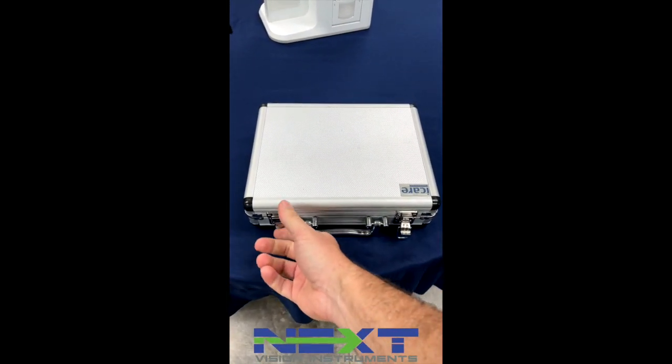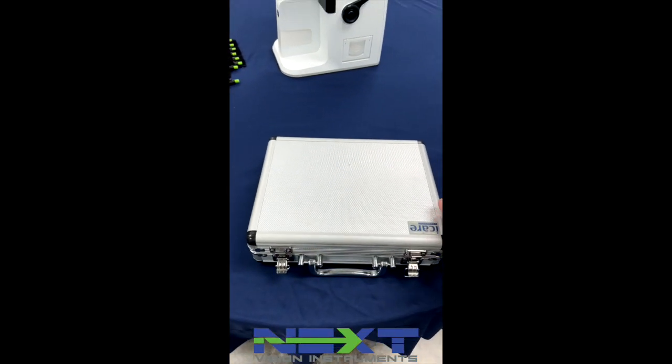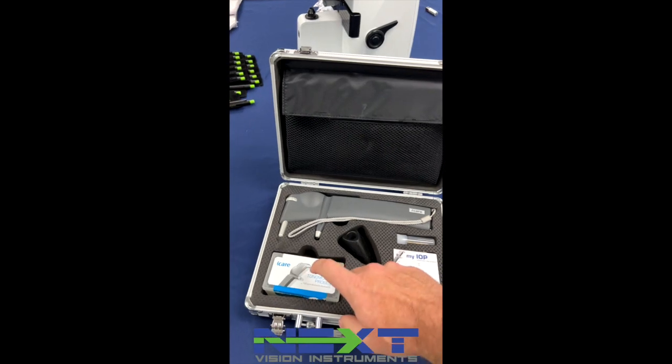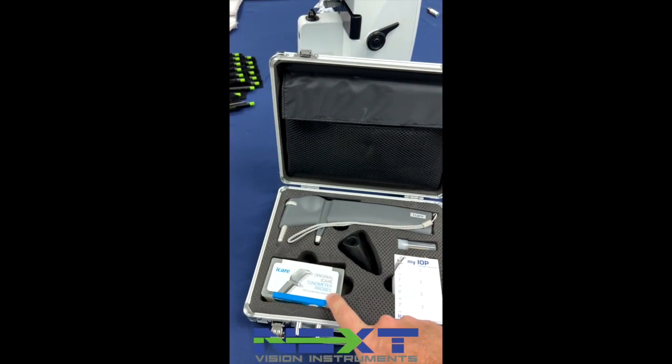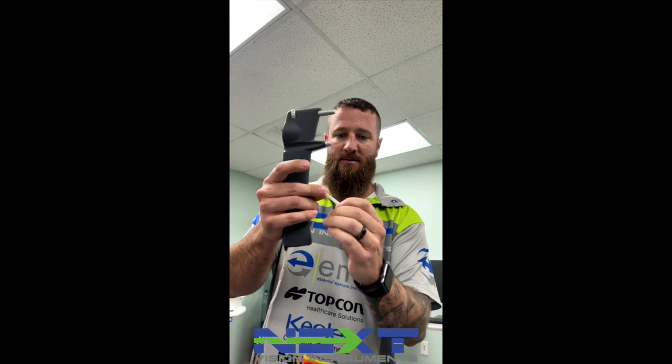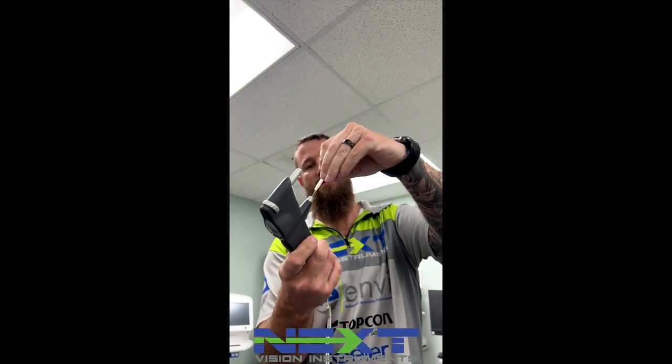We'll put in the case and disposable tips here. Your probes will come in a case like this. Pop the top off, drop it in the box. Without touching it, you load the tip.